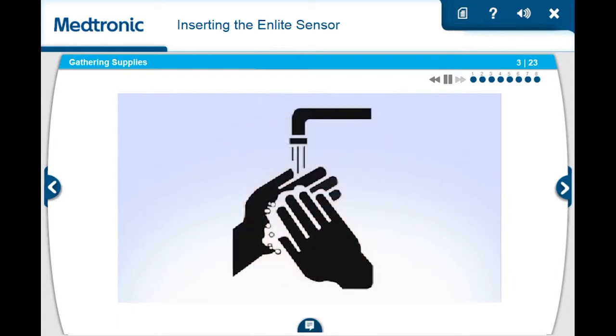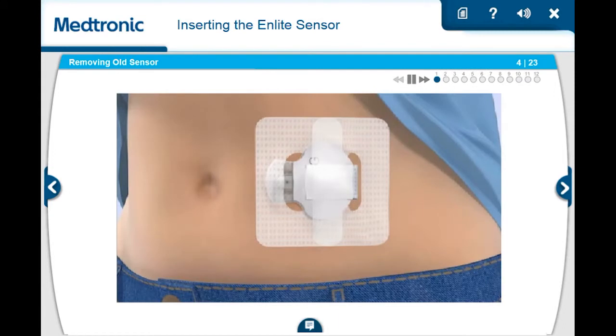Wash your hands before you begin. Before you insert a new sensor, you will need to remove your old sensor. If you are not currently wearing a sensor, please skip to the next section.